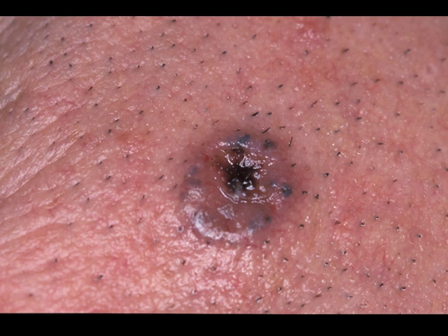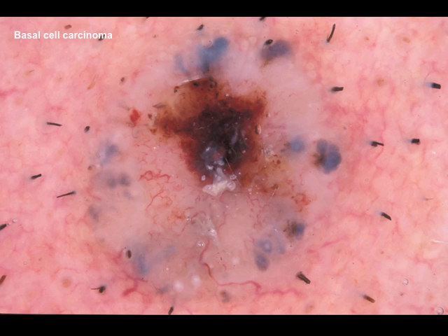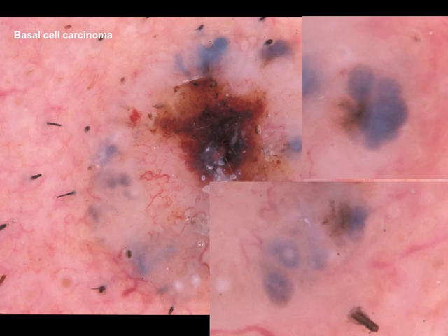Picture of a pigmented basal cell carcinoma clinically. Dermoscopically, we see central ulceration, arborizing telangiectasia, but at the periphery these large leaf-like areas, blue in color, sharply demarcated, corresponding to pigmented tumor nests.